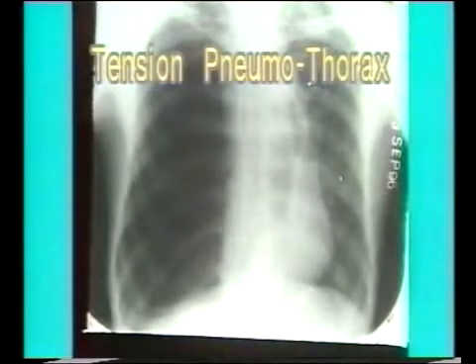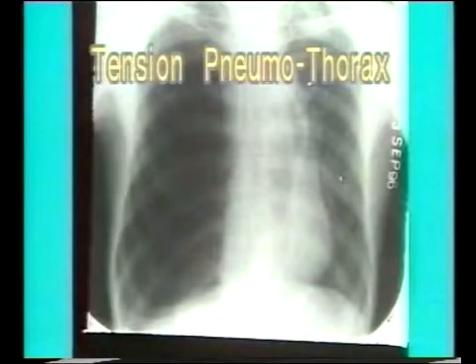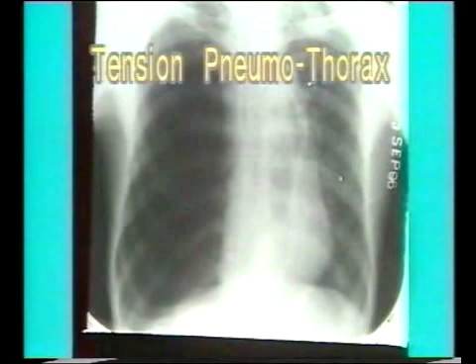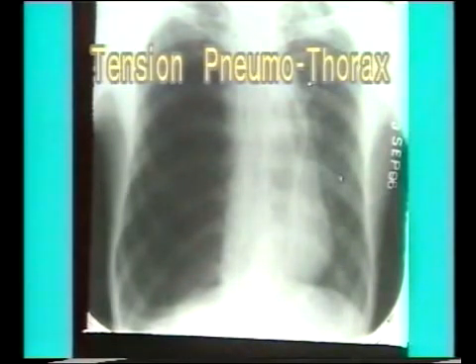This is another X-ray of tension pneumothorax. Note the complete radiolucency of the right hemithorax with shift of mediastinum to the opposite side. The diaphragm is pushed down to a level lower than the left diaphragm and intercostal spaces are widened.